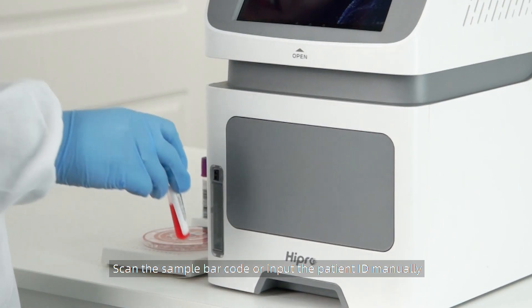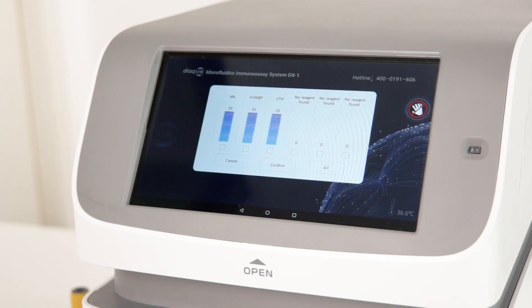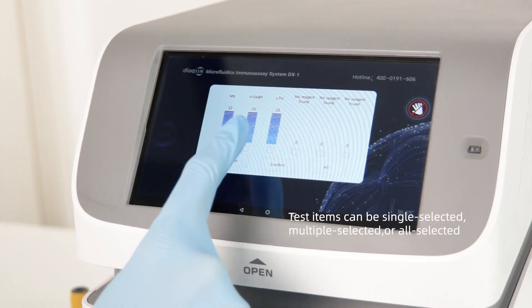Scan the sample barcode or input the patient ID manually. Then select the test items and press Confirm.